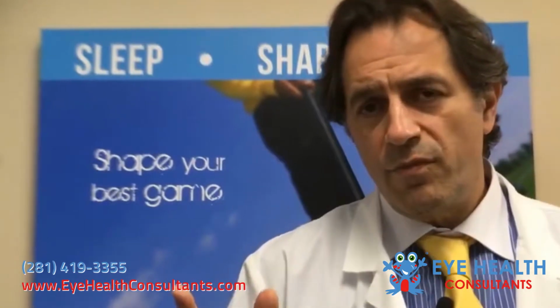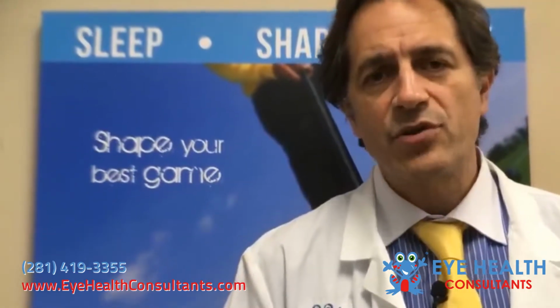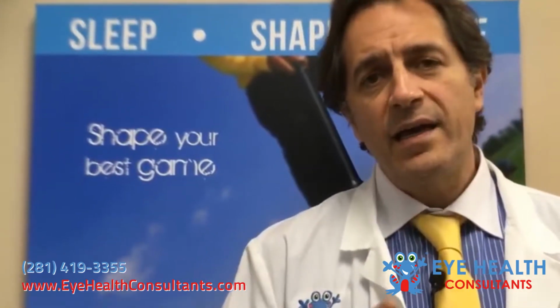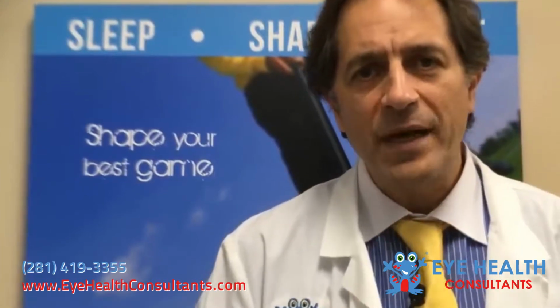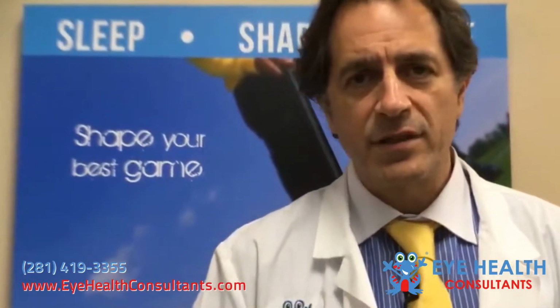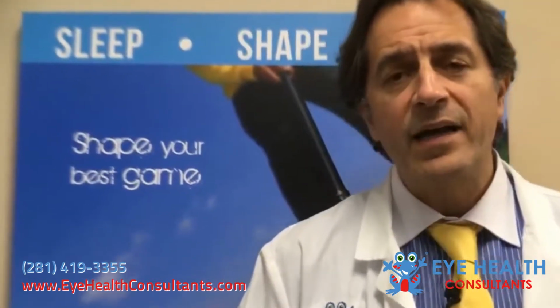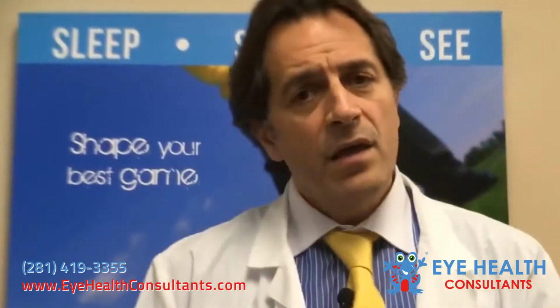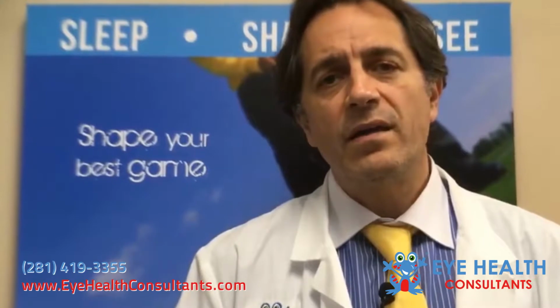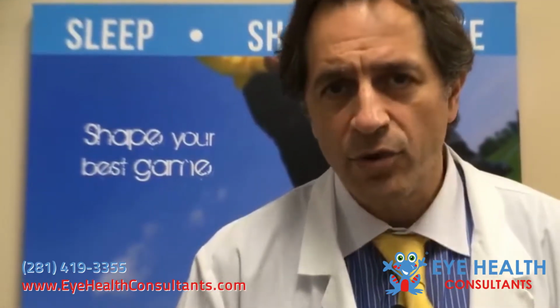As a very quick refresher, corneal molding is a non-surgical vision correction modality which is reversible, and it serves the purpose of liberating the patient from wearing glasses or daytime contacts all day long. This is done non-invasively, and it works very, very well on many people. It doesn't work on everyone, and this is the main reason why we bring the patient in to know for sure if you are a good candidate for corneal molding.